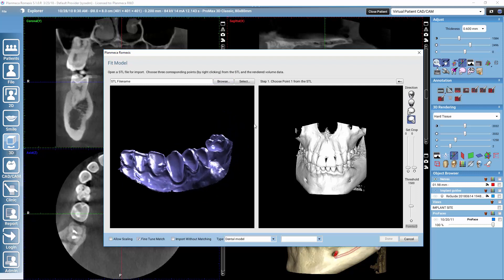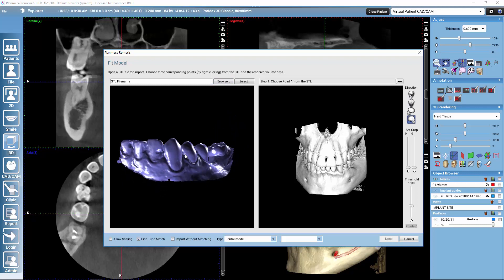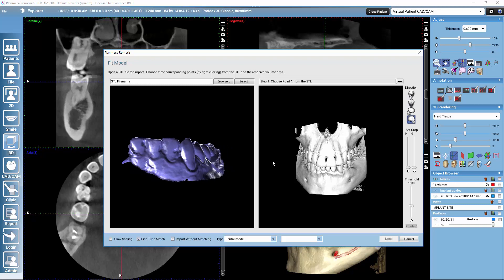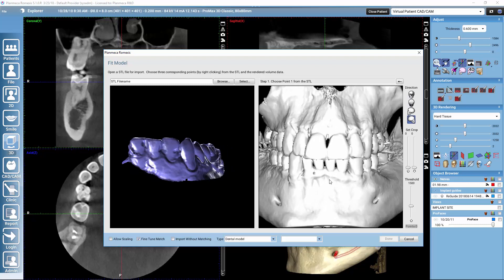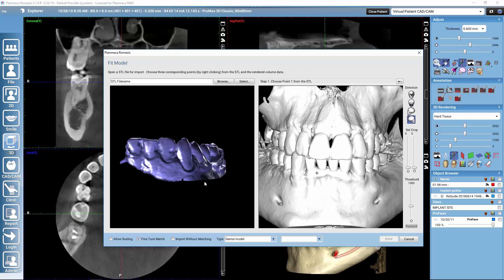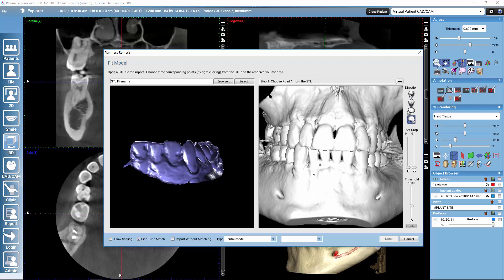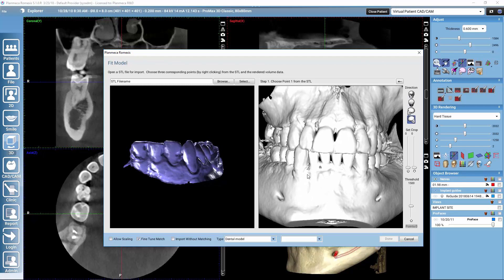The idea with this fit model tool is that we need to select a minimum of three points in common from both of these images. A tip so that the match would be the best: always when you are looking for a common point, rotate the models so that you are looking at them from the exact same angle. For example, if I want to select the first point, it is good that I have the CBCT from the same position so it will be more probable that I select the exact same points from both images.